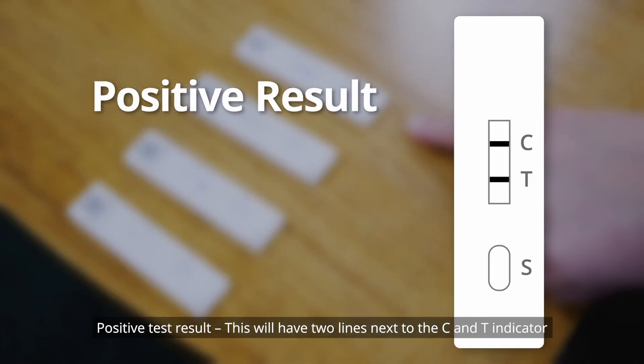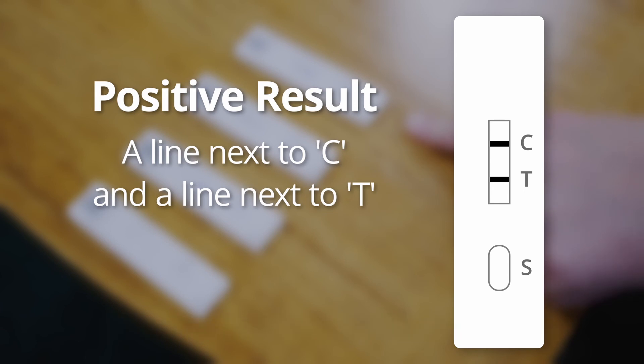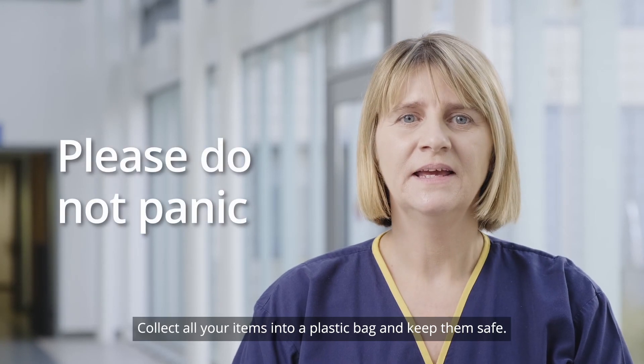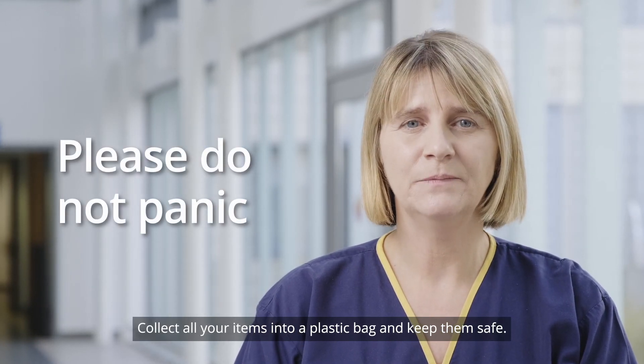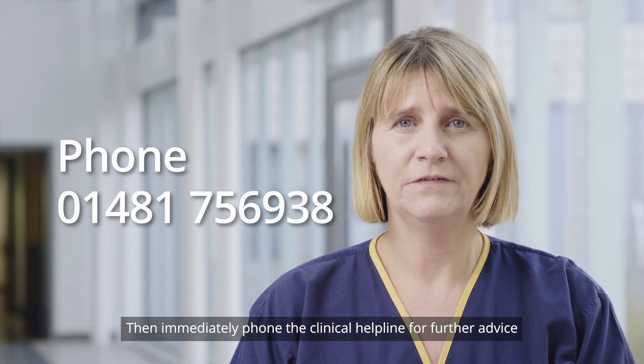Positive test: This will have two lines next to the C and T indicator. If your result is positive, please do not panic. Collect all your items into a plastic bag and keep them safe. Then immediately phone the clinical help line for further advice.